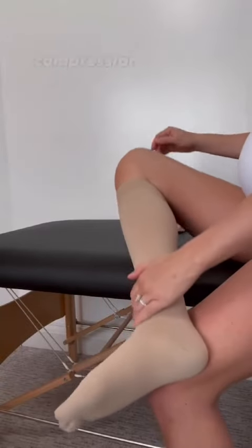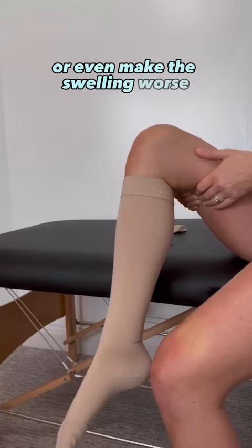Wearing the wrong size compression stocking can cause pain and skin issues, or even make the swelling worse. So how do you fit for the correct size?